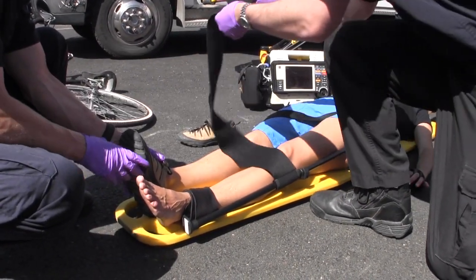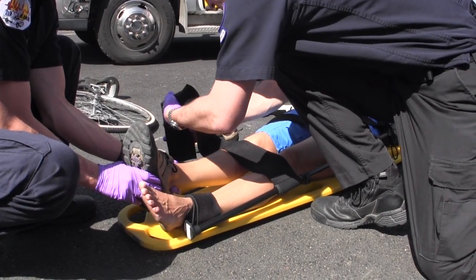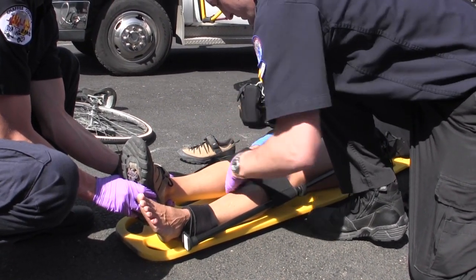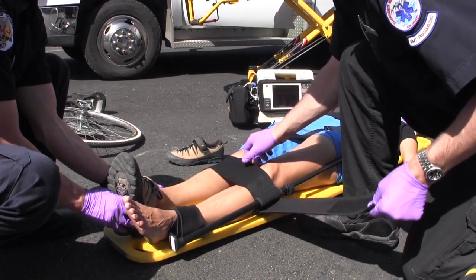The single pole is robust and keeps its shape without the mid-leg straps required by other portable traction devices. One mid-leg strap is included to provide rotational stability by binding the legs together, but it's not required to maintain traction.